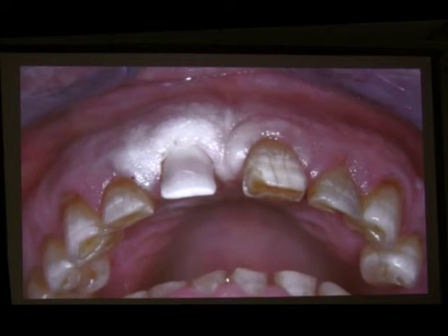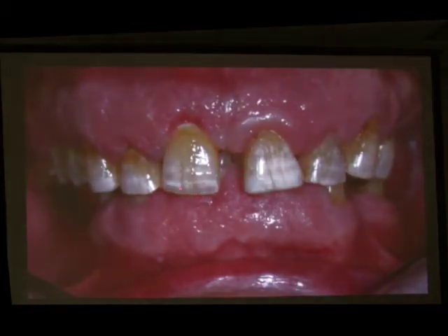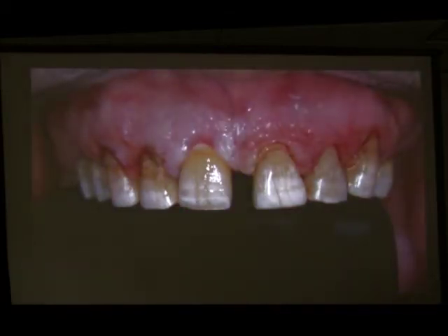And this looks like burnt gum, but it's a projector. There's a little bit of ischemia, but not that much. And we use this type of zirconia crowns with some porcelain. But even if there is chipping, it will even look more natural. It will look like it's a bruxer, so no problem. And this is the level of the implant. This is the shoulder of the implant, and we make the gingivectomy, and then we go ahead and do the gingivectomy in all the teeth in order to treat the lesions.